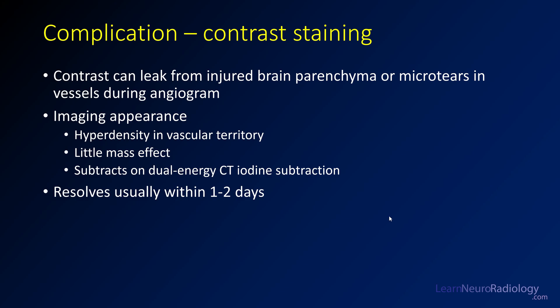Contrast staining is another complication, particularly in patients that have had an intra-arterial intervention. This is essentially leaking contrast from the brain parenchyma or microtears in the vessels during angiography. We get hyperdensity in the vascular territory with little mass effect. If you do dual energy and get iodine-subtracted images, you will see that hyperdensity decreases. Usually this washes out within one or two days, so if you don't have dual energy CT, you can just get a follow-up in 24 to 48 hours and most of the time that's going to go away.